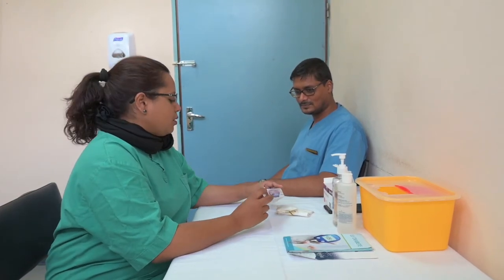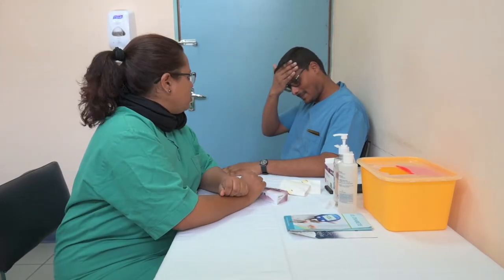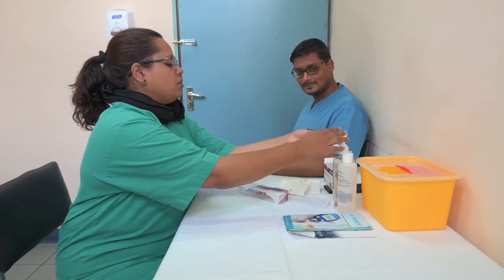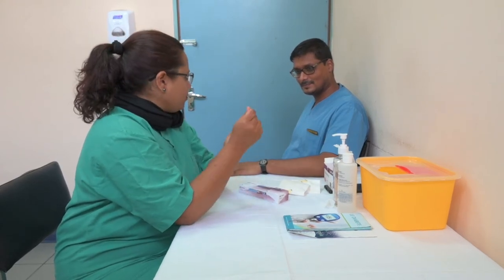As per the lesson plan that we have been discussing, now I'm going to teach you about an insulin pen. Okay? To start the procedure, clean your hands, sanitize them, or wash with soap and water.